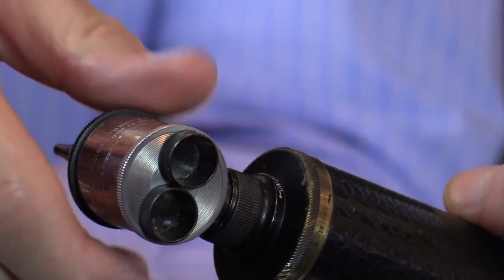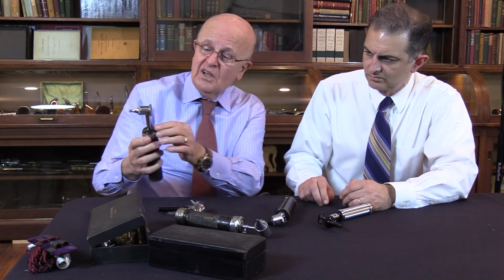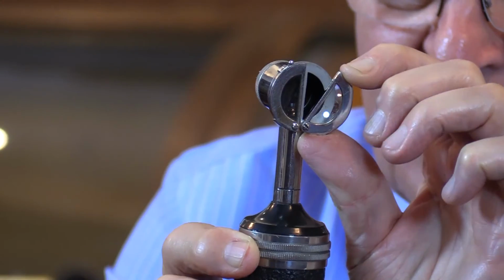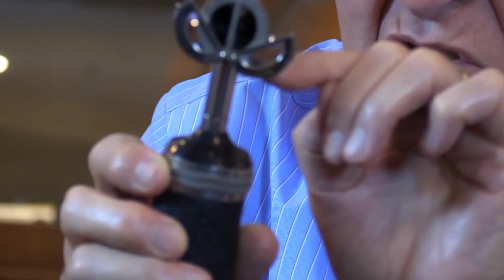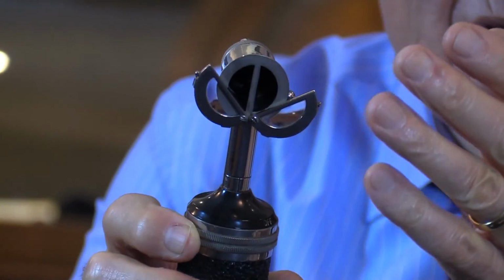Yeah, Joe, in fact, I have a sample. I don't know where I put it. One of them doesn't have a lens, it's just an opening for introducing instruments, and the other side has the lens. And a fascinating one that I want to share is this here, where it has two half lenses.